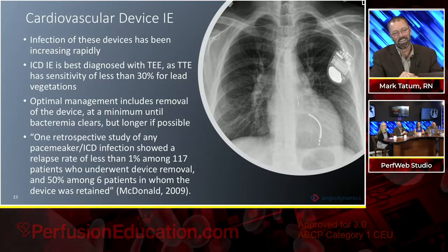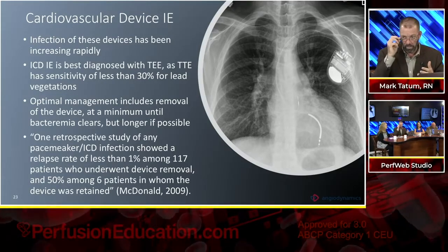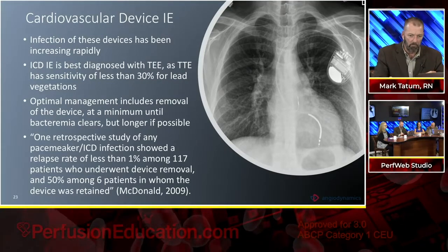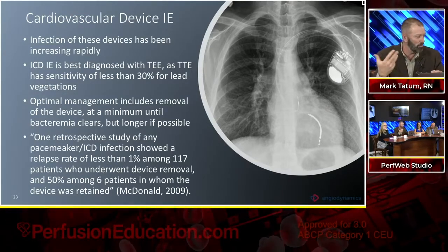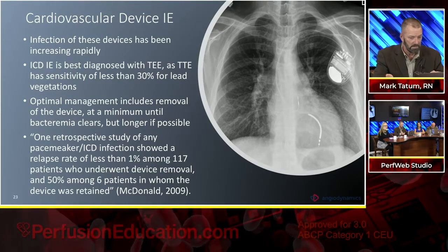That's awesome. Yes, pull and pray is one thing, and when you talk with interventional radiology, they'll tell you that the lungs are the world's greatest filter. I've heard that more times than I care to count. But to a certain degree, it's the God's honest truth. If you have normal PA pressures, et cetera, you can send something to the lungs. It'll either dissolve or a patient will do fine.